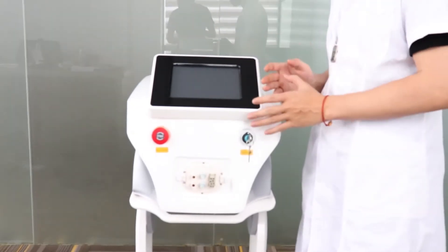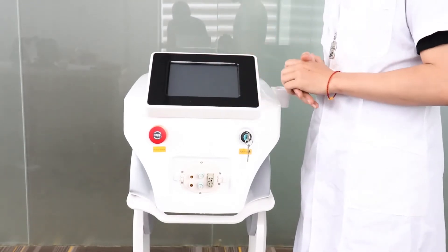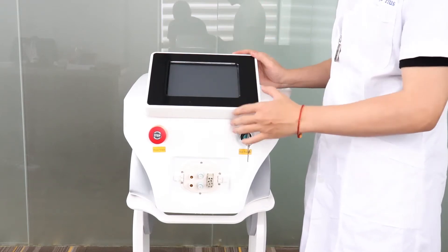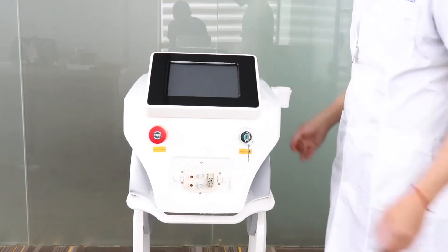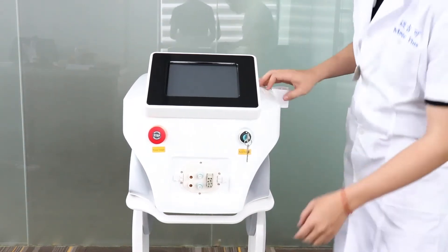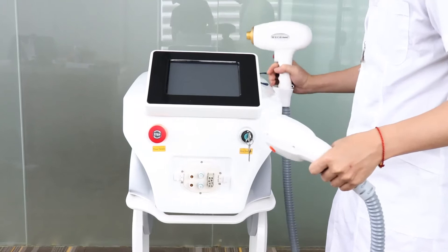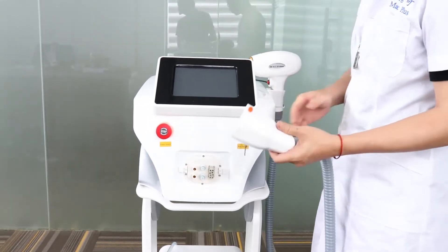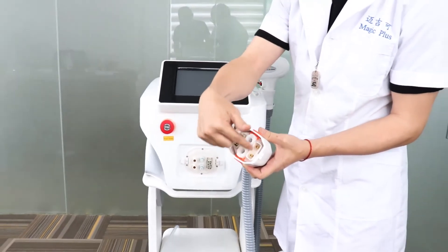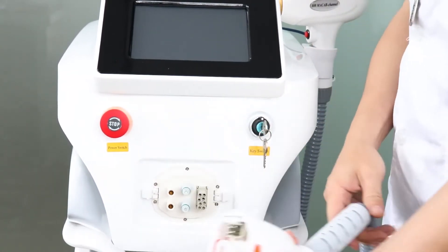How to add water, how to install handle pieces. First, after you get the machine from our factory, the first step is to insert and connect the handle pieces. Put the handle holder over here, then use the handle — put the handle on the holder first. Then we connect the handle piece before we add the water. You have to match; each point has to connect completely to the machine.